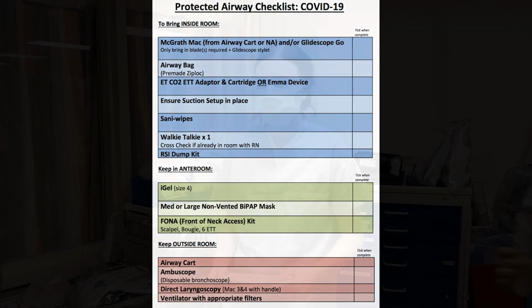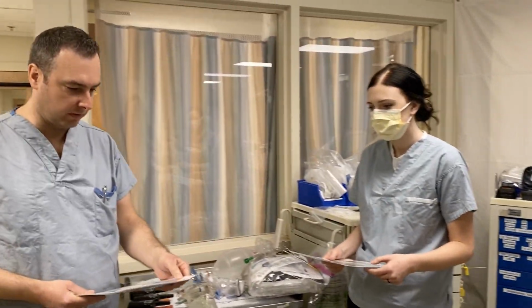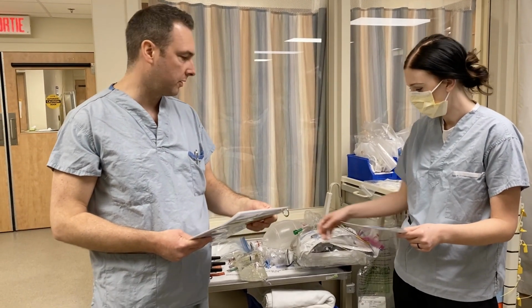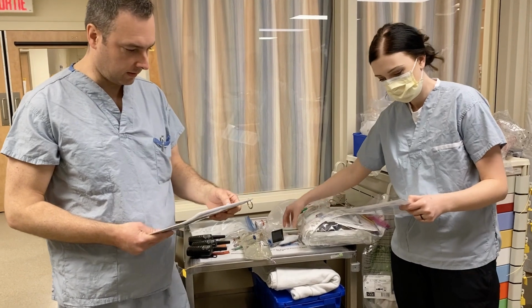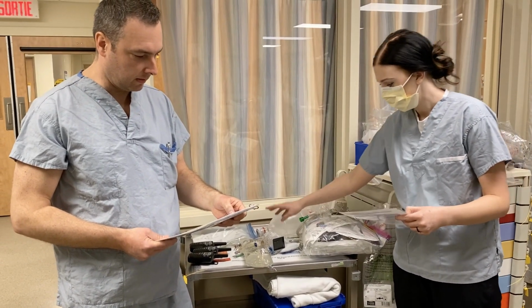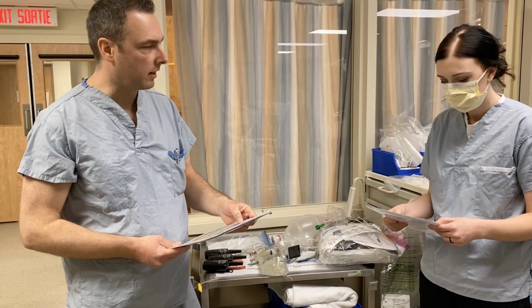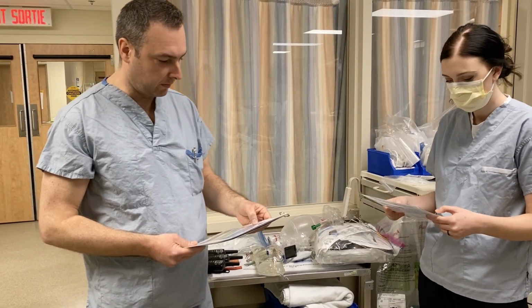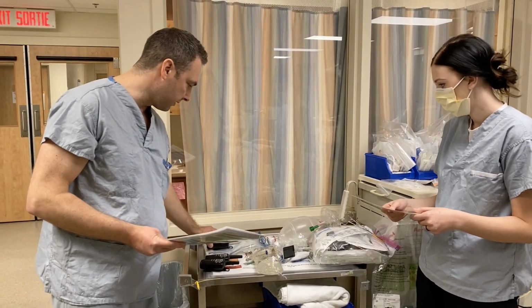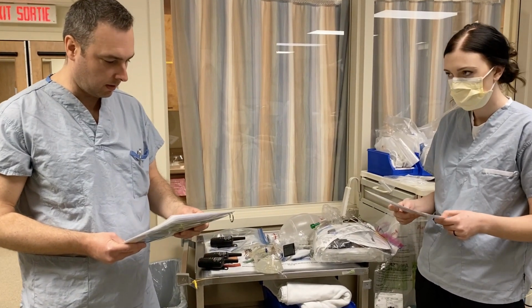All right, Lacey, so I just want to go through and confirm that we have what we need for our airway equipment. Yes. So, do we have either a McGrath or a GlideScope Go? Yes. McGrath back check? Yep. We have our airway bag that's pre-made. Yes. We have an end-tidal CO2 adapter. Correct, right here. Perfect. Our suction setup. It's in the room. Perfect. Yep. And we've got wipes in the room. Yep. We have a walkie-talkie. We have one set aside to come in the room for us. Perfect. And your RSI drug kit.